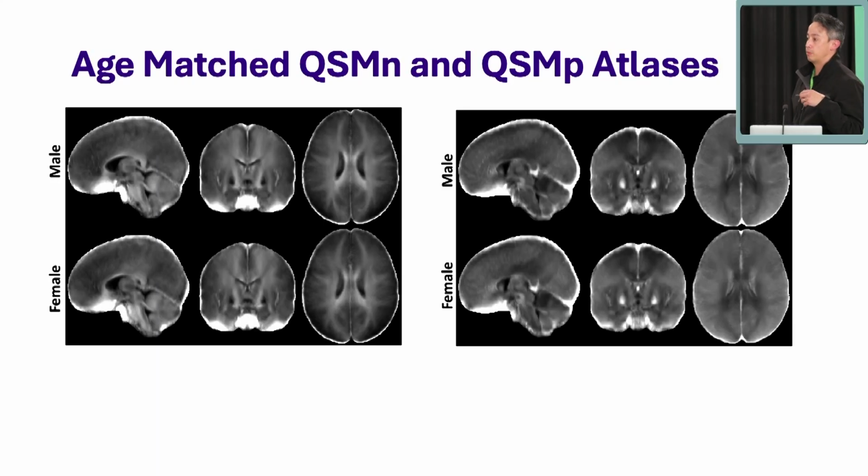And so what we did is we looked at 100 cases of normal brain MRIs from boys and girls, and created an atlas. We smushed them all together, gave them an average. So it's essentially your control group. And then you can take your ALD MRI and put it on top of that atlas and look at where there are changes from the control group.